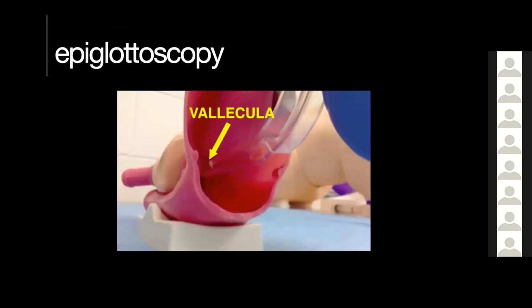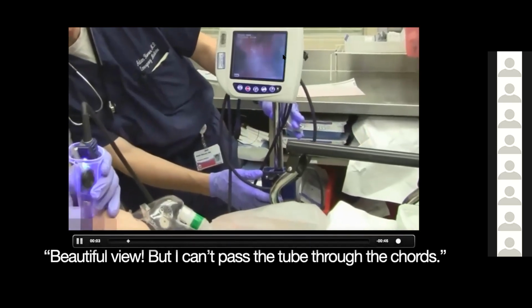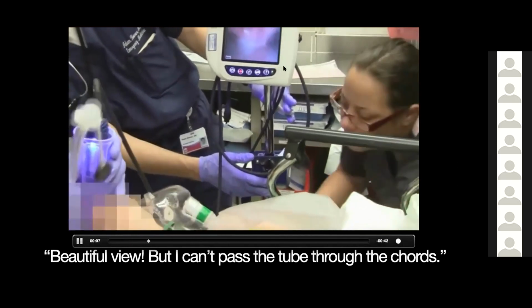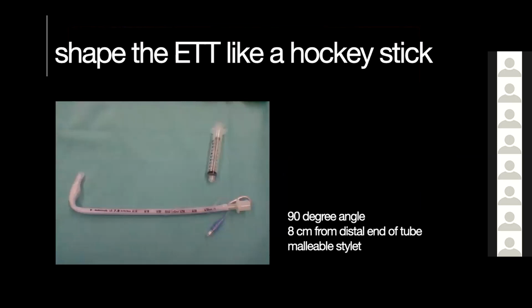So my tip number 3. When you see, I'm just going to go back 2 seconds, that you are struggling like this, so your tube keeps hitting the arytenoids, it's really not working. Even though you've tried your best and you pull back the scope, you're not able to pass the tube through the cord. What can you do?